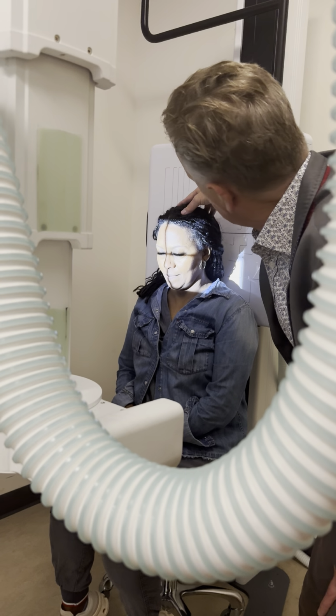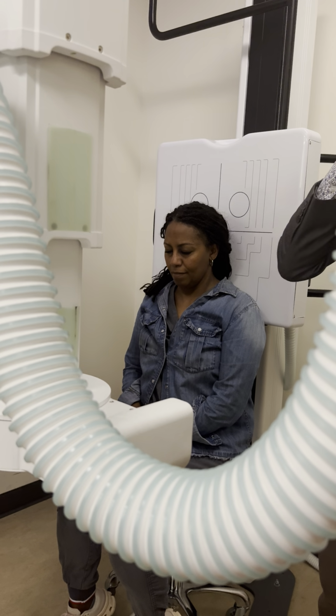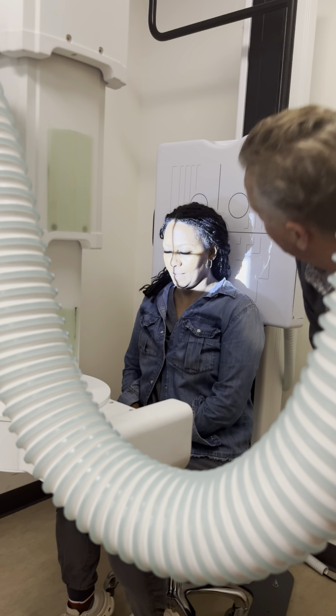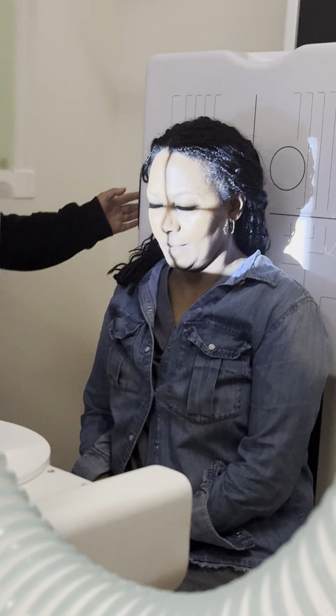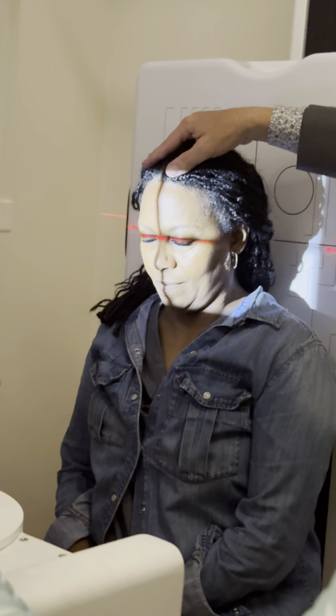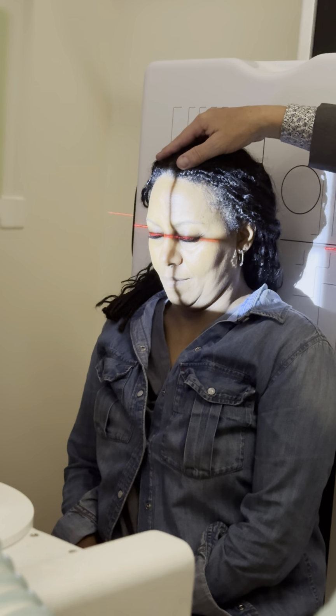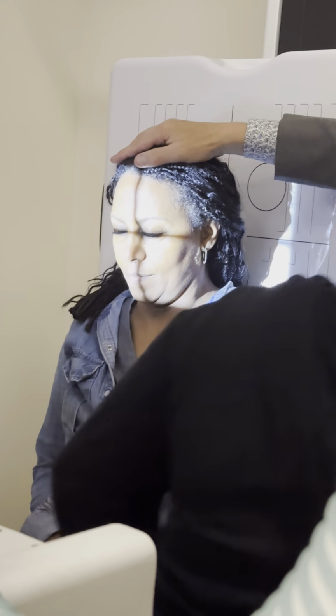I'm going to move her around slightly so that she's at the mid-sagittal. I don't want her turning left or right with her face. I want her right down the middle of it. Just change the image receptor so that it is left or right. She needs to tuck her chin slightly down. We should put the correct mark on the correct side. Keep her chin down.